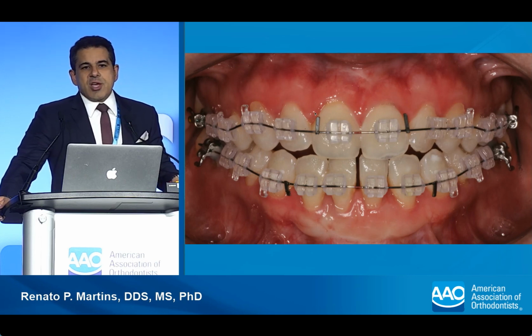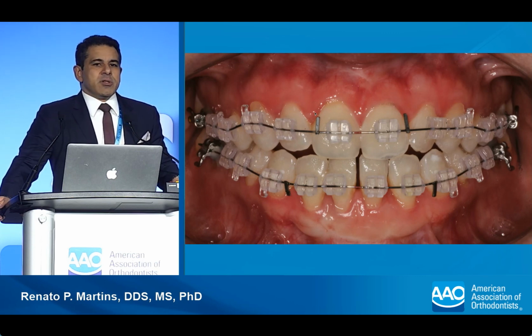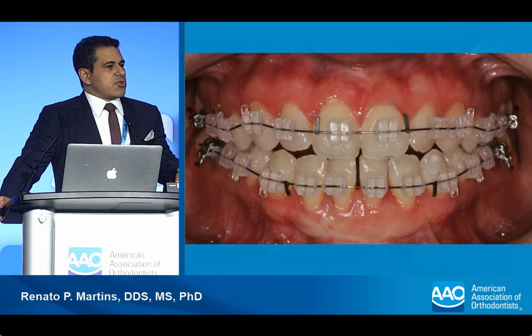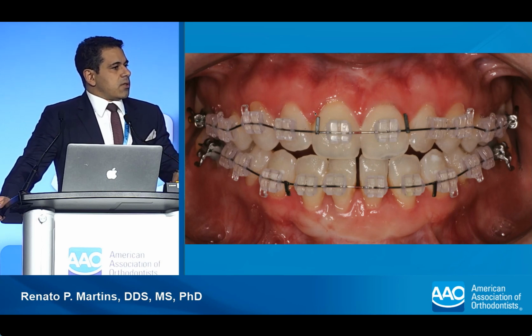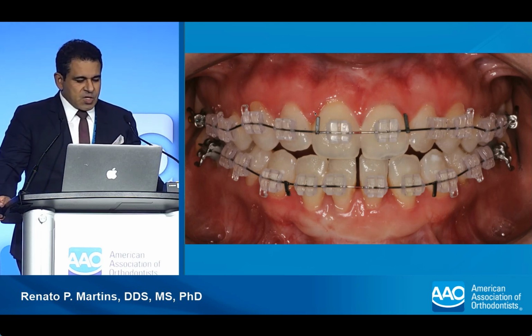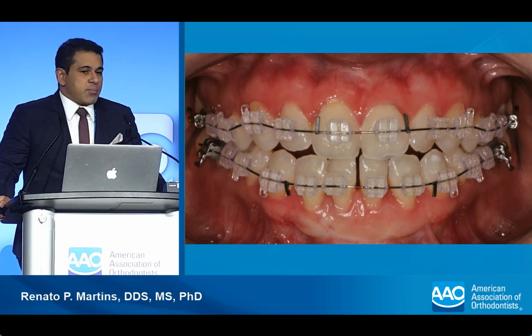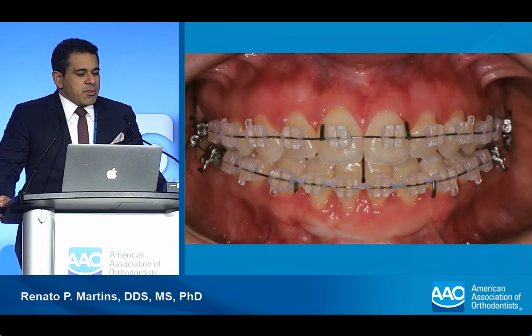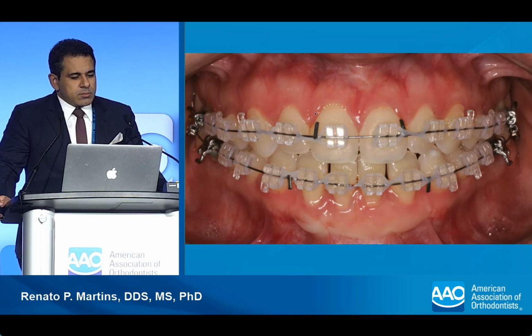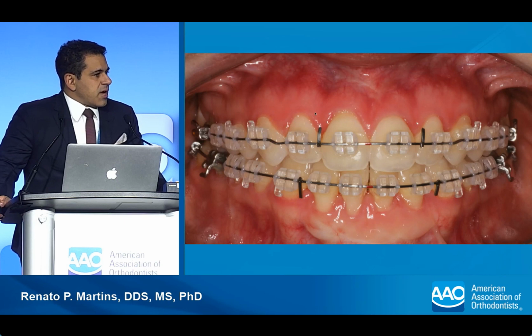You can notice that she has hooks, so they're nitinol pieces electrically welded into her first arch wire, and she's going to use open anterior box elastics at the same time, right at the beginning of treatment. So this is month 0, ground 0. We bonded both upper and lower. This is 1 month. This is 2. This is 3, and I placed the band on the nitinol rectangular.